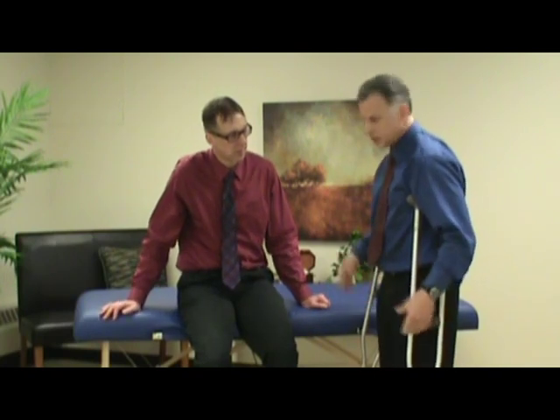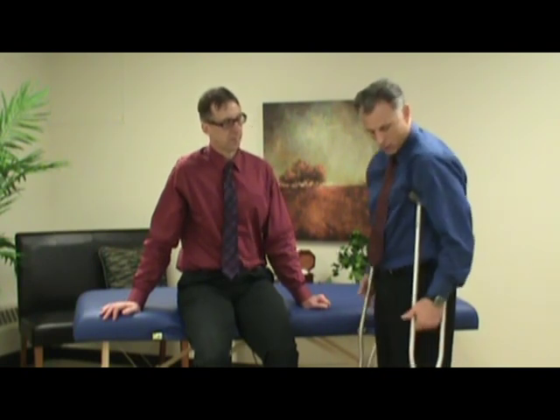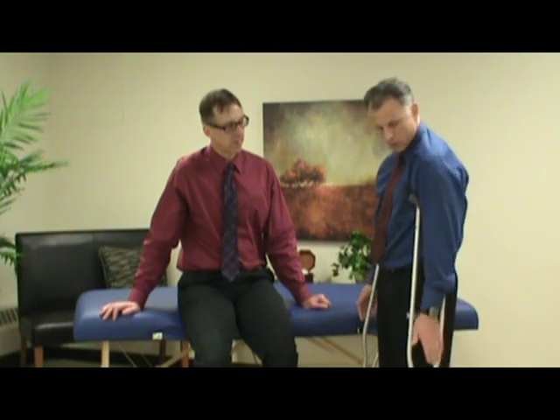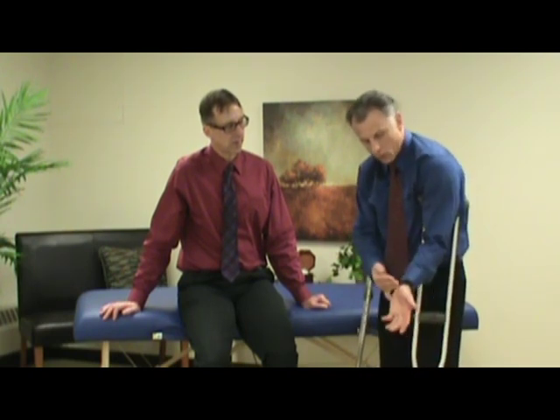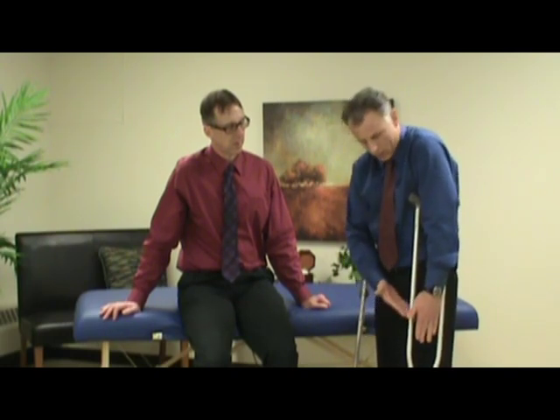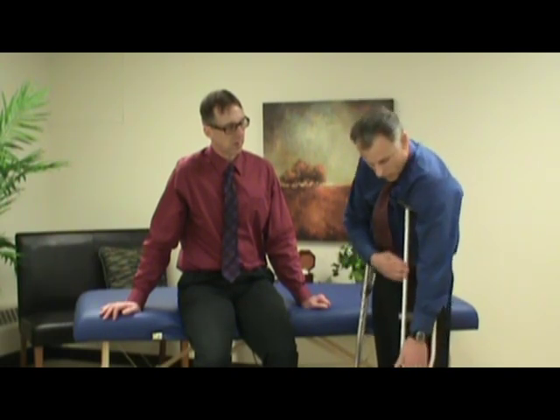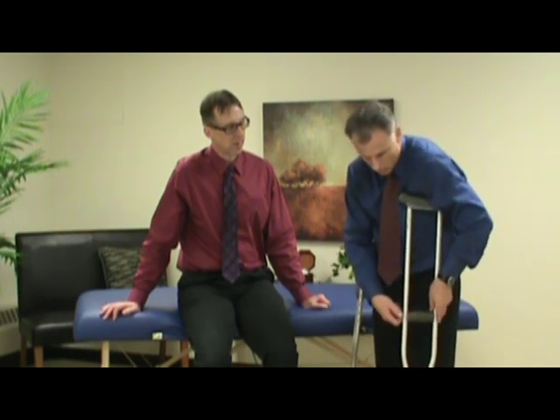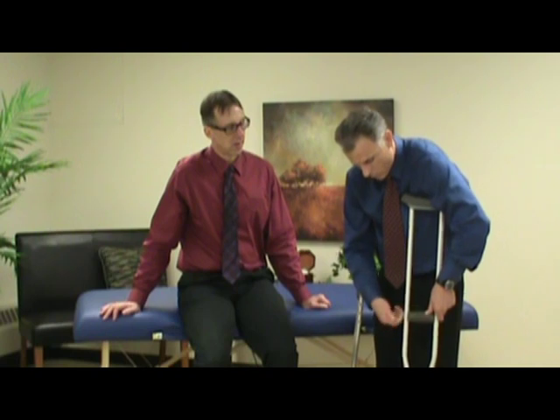What I do is I say stand up, good posture, tall, let your arms dangle, and put the crutch where you're going to have it when you're walking. Some people like them out a little bit, some like them in a little bit, wherever you're going to walk with them. Let your arm dangle. The grip should go right at the crease of the wrist. If I was up here, I would need to adjust these up. If I was down here, we would need to put these down. The way these adjust is a little more work, and most of them are like this that I've ever worked with: a little thumb screw, wing nut on the end.